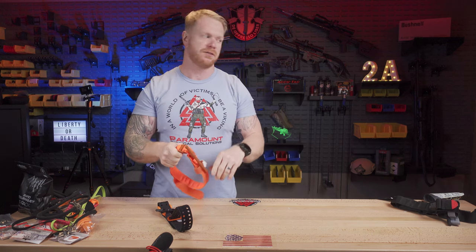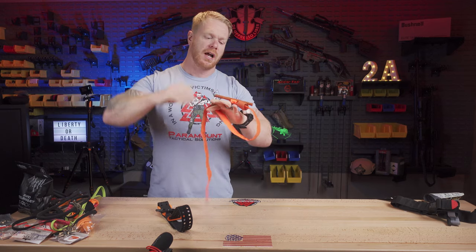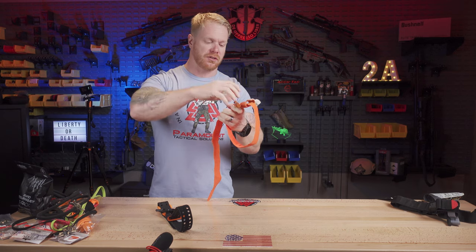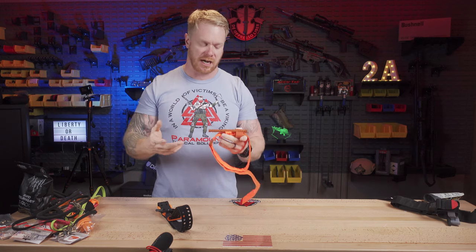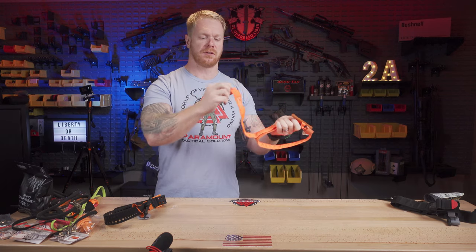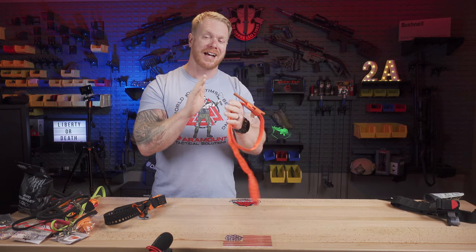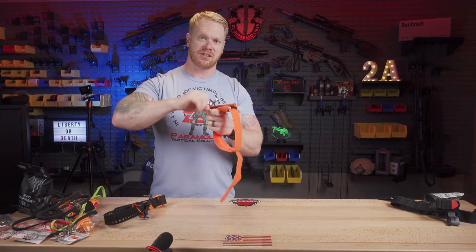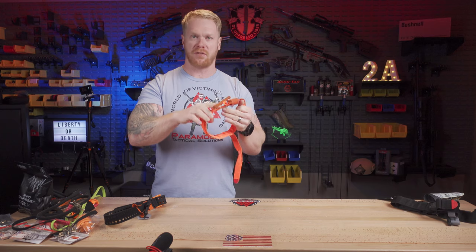We see this in training all the time — even after students get a couple of good reps, they're still not pulling it tight enough and not remembering to secure enough Velcro. When they start applying the tremendous force the windlass can generate, it breaks free and they lose the tourniquet. The other shortcoming I've seen personally in combat is that it has a phenolic plastic or polymer windlass. In 2008 in combat, we actually put two of these on a guy with an amputation on the leg and snapped the windlass on both. We ended up throwing a different tourniquet on there — a Soft-T — that took care of the problem. So we still have this plastic windlass that could potentially break.